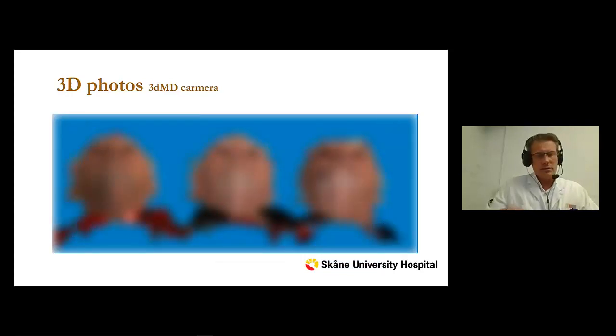One can rotate this image, and if you look closely, you can see that from November 2018 to prior to surgery, this lump has grown a little bit. So in the time before surgery, he had a pressurized feeling in the right eye, so it was quite urgent to get this surgery done.